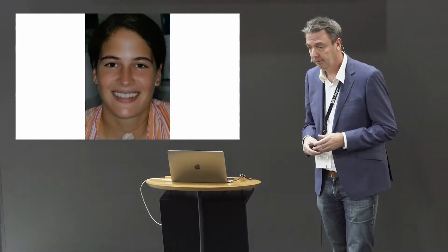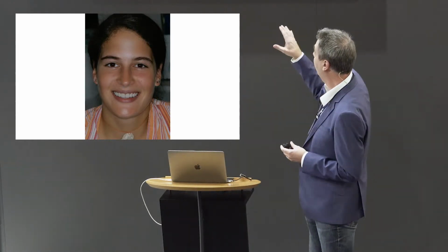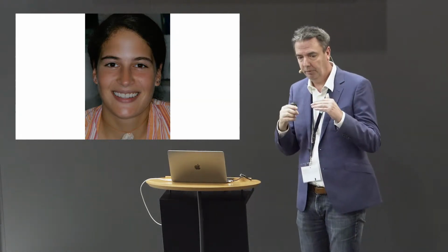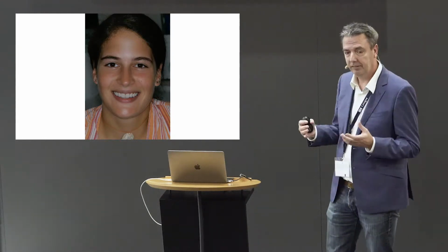And what I love in this case is, as you can see in the before picture, the lower third of the face of the patient is very triangular. It's not very harmonic. The face is not ideal. Next picture, it looks totally different. And the only thing we did, 8 veneers. We widened the buccal corridor. We created a very minimal length difference between the central, the lateral, and the canine. And because of this, the face looks wider. And this is the reason why the face now looks much more balanced.